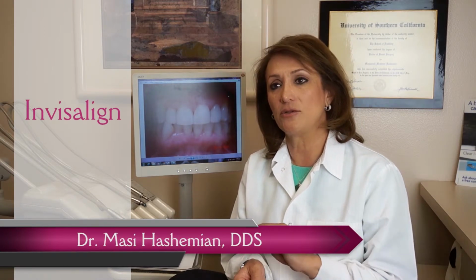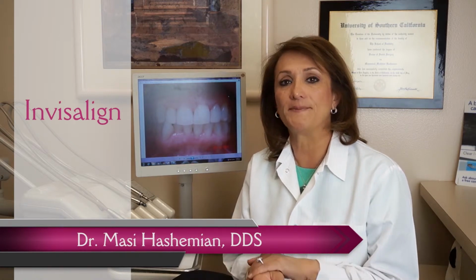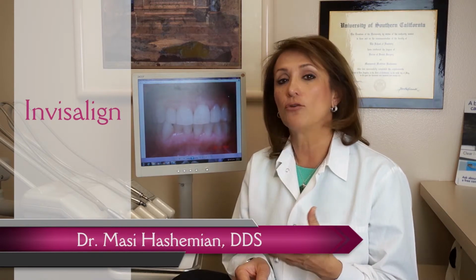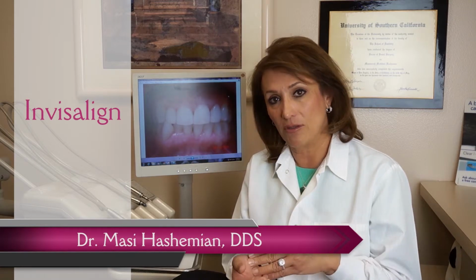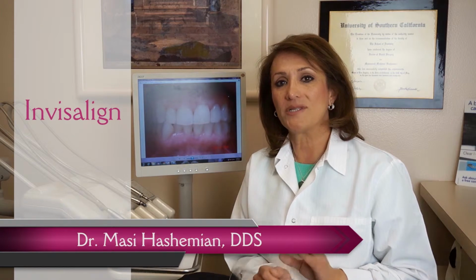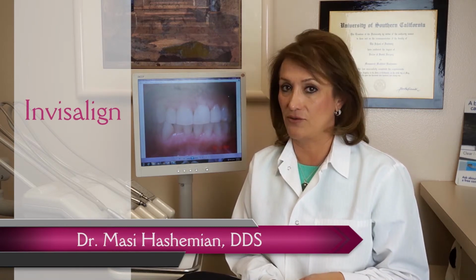And then once you finish the whole series, and it depends on how many aligners it's going to take to move your teeth or shift them to the correct position, once you're done with that, it is crucial, I require from my patients to retain those teeth. That's a big investment you're doing. You might as well protect that investment. Retaining, I insist on wearing the retainers, and you can have clear retainers, about 6 months to a year after you're done completely with your treatment.